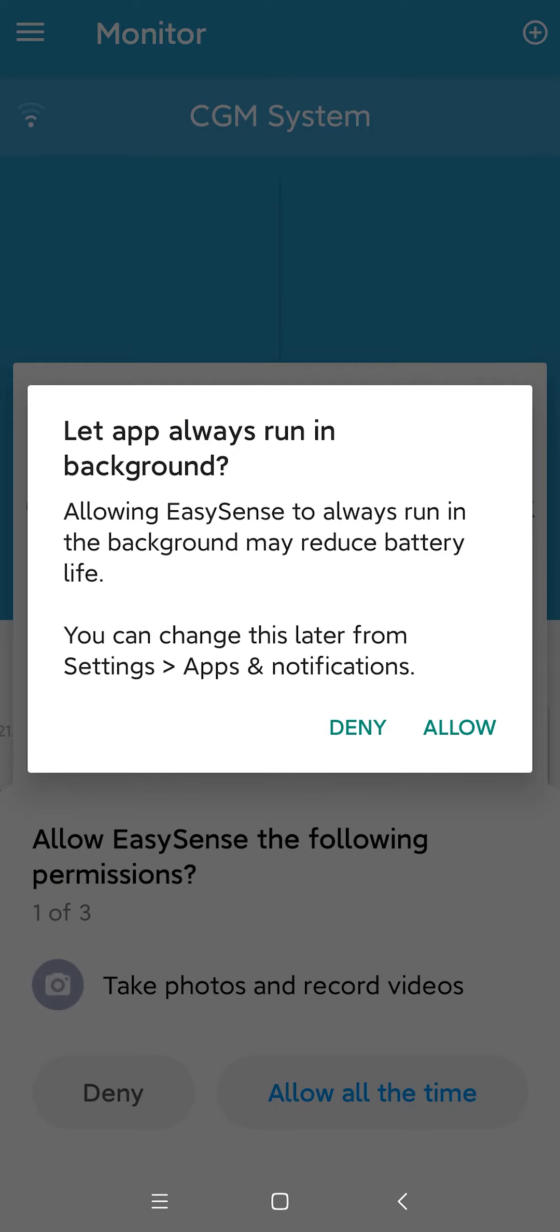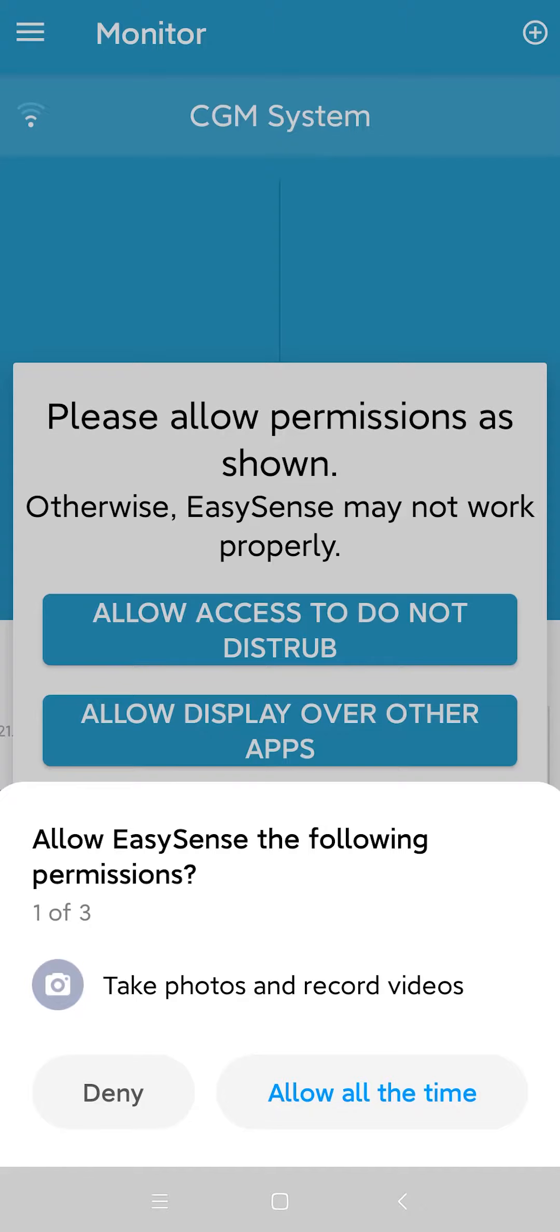Tap Allow on the following page to allow the app to run in the background. Click Allow all the time to give permission for the app to take photos and record videos.